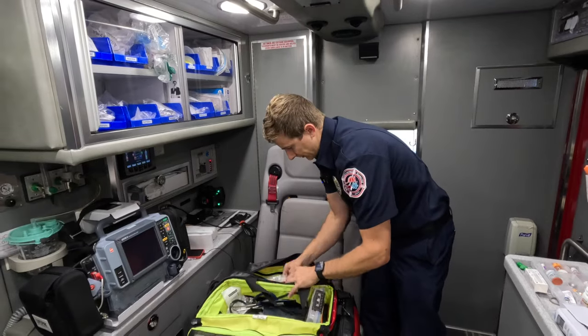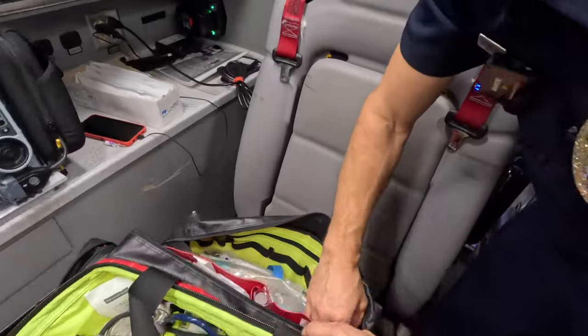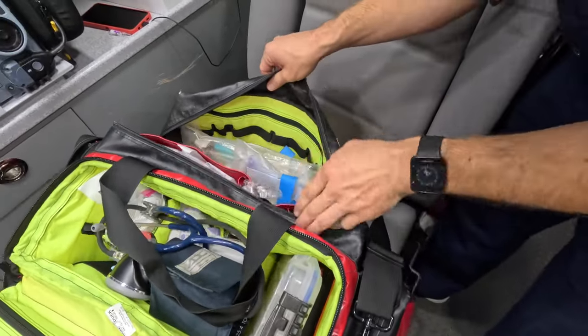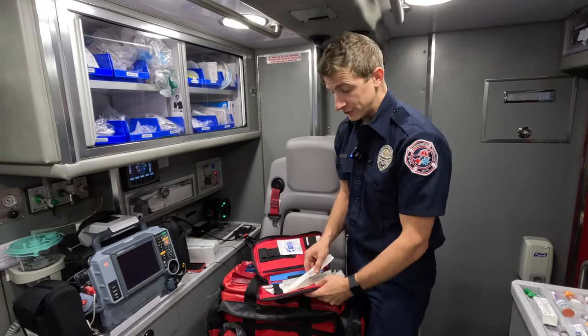Check this side too — got a blood pump and some IV start stuff. I like to go through everything and make sure we've got everything we could possibly need for any emergency, really.